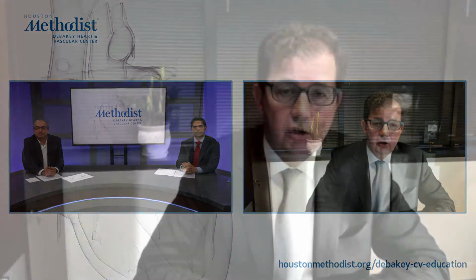Yeah, so this particular study did include some patients with acute antibody-mediated rejection, and we do see higher values of T2 and ECV in that particular group as well. The numbers are very low. I think that's probably reflected in clinical practice, that it's less common than cellular rejection. So I don't have any data to support whether ECV could distinguish the two from each other. But we did see similar findings of abnormal T2 and ECV in that small group that we had in our cohort at least. Okay, great.